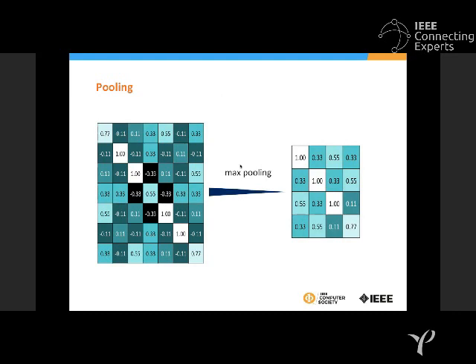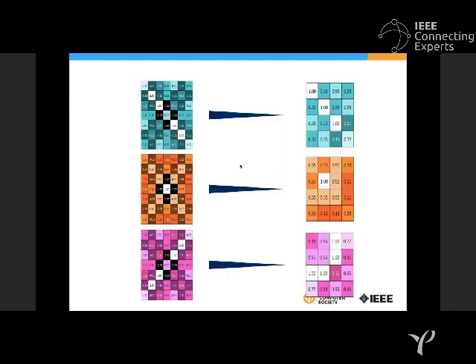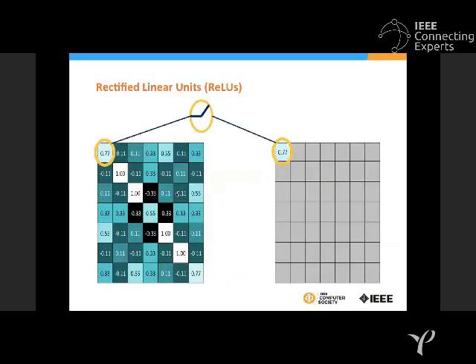Similarly to the convolution outcome, where we have an outcome for each independent filter, we have the pooling outcome of each independent filter. And last but not least, I now need to pump out those values which really contribute and suppress those which don't.